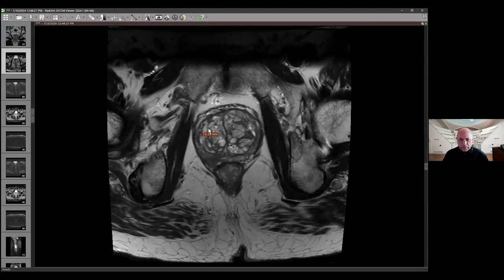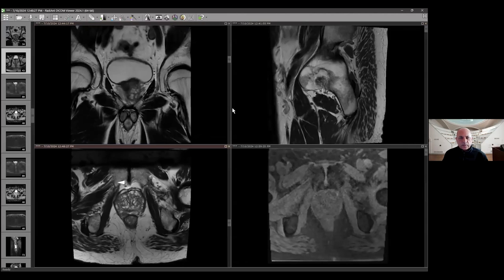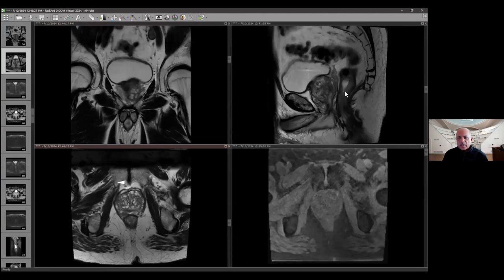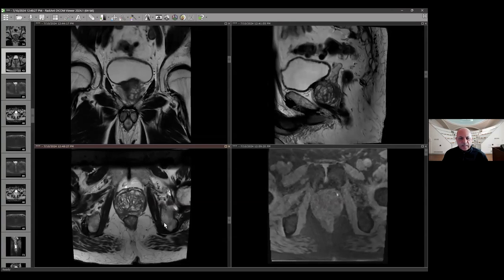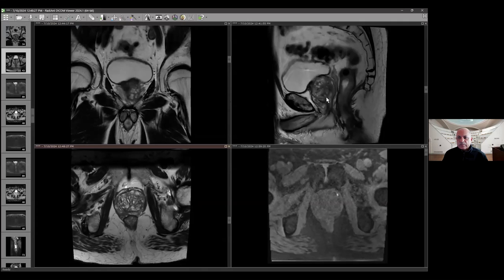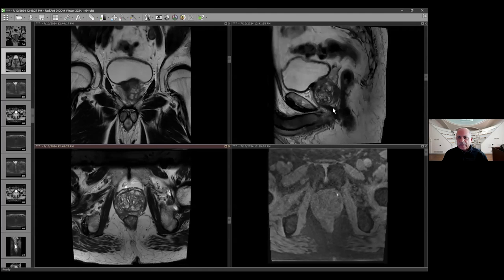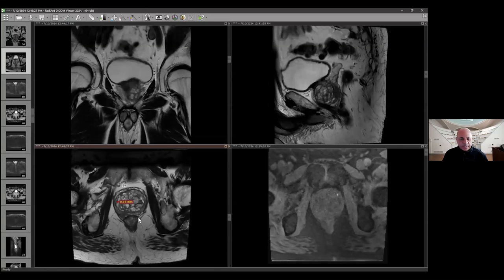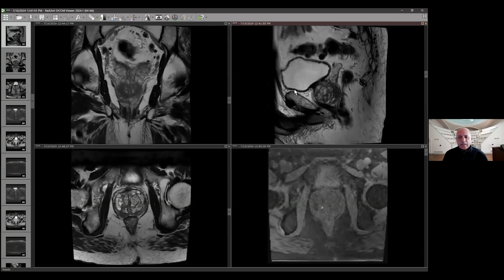Going back to the sagittal, in this case you can see on the left side the peripheral zone shows a nice C-shaped bright signal. When I go to the contralateral side, from the base almost reaching up to the apex there is a dark signal or dark area. On the coronal, cross-correlating this location, you will see it's spanning from base almost to the apex of the gland. That is clearly concerning.